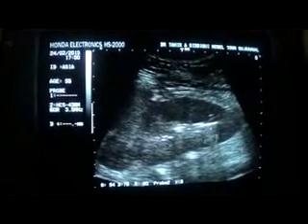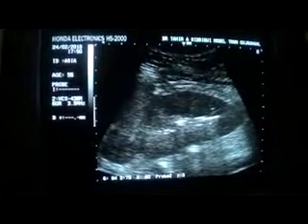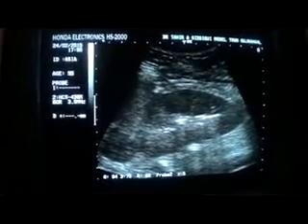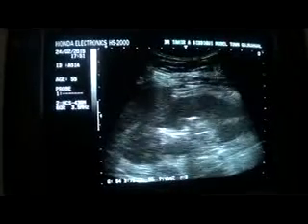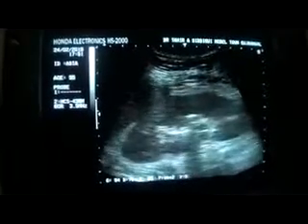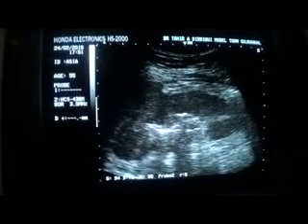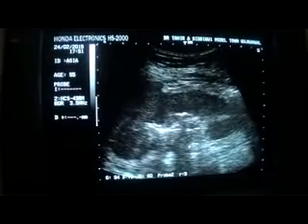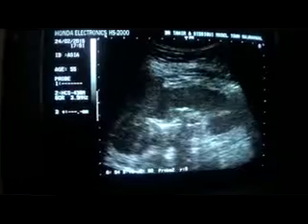Now you see these dirty shadows. Calculi or calcified areas will give a sharp posterior shadow, not dirty shadows like this. So I have my reservations regarding this, as CT scan will be required. I am only provided with the urine report, which shows proteinuria, hematuria, pyuria, as well as glucose 2+.